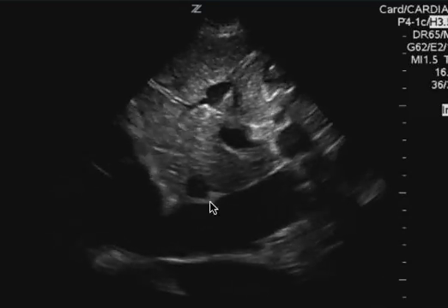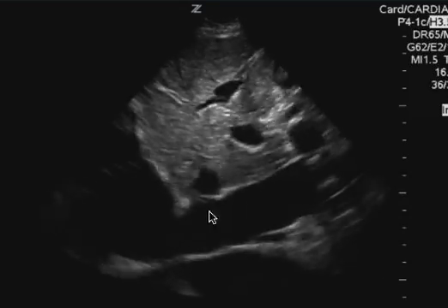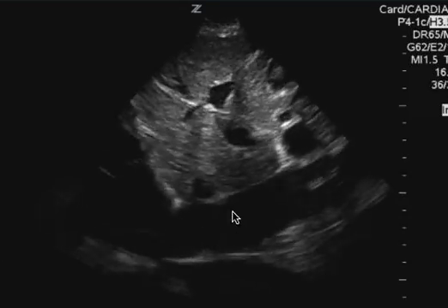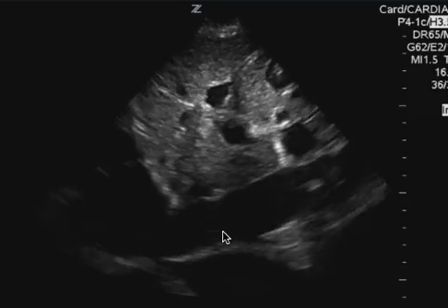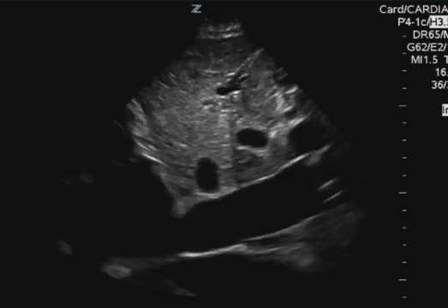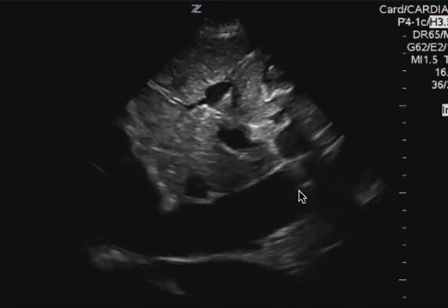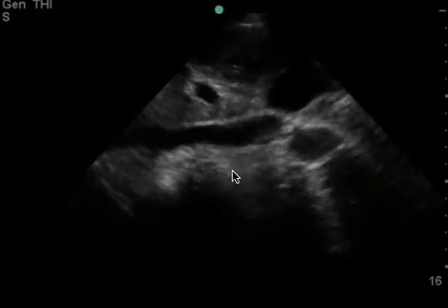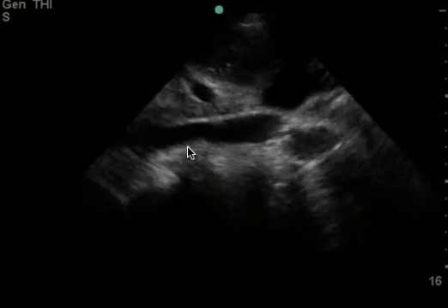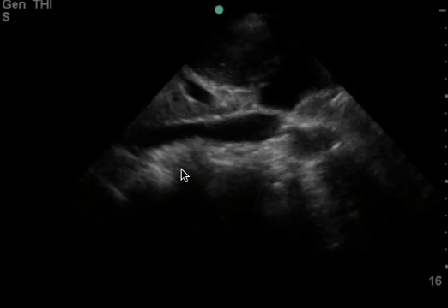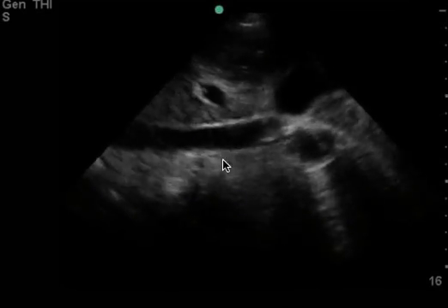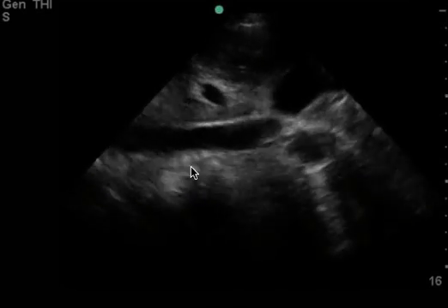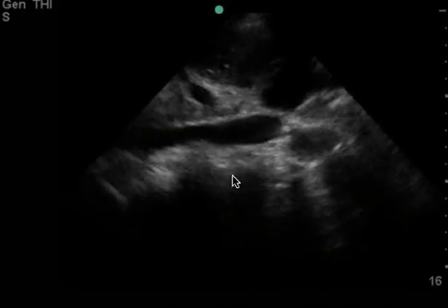This is what I want to see — this is the part where you want to look and see if the IVC is collapsing or not. Compare this with this other clip, where you can see that you don't have the heart in view, nor do I see the hepatic veins entering into the IVC.